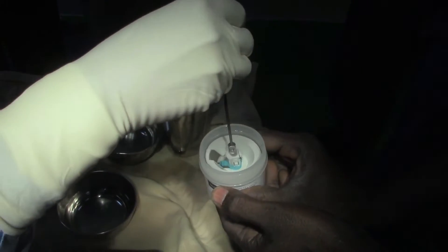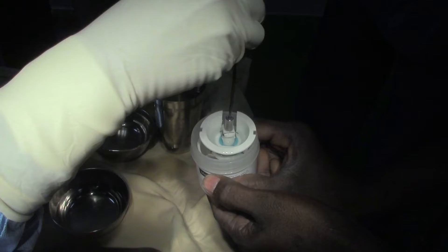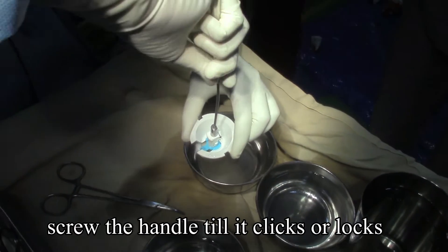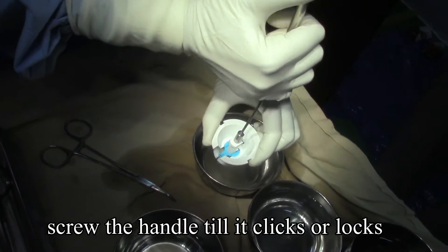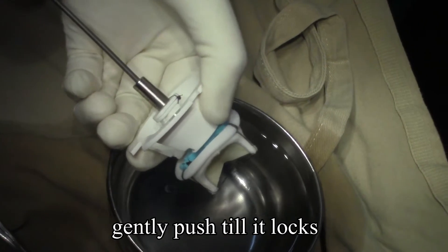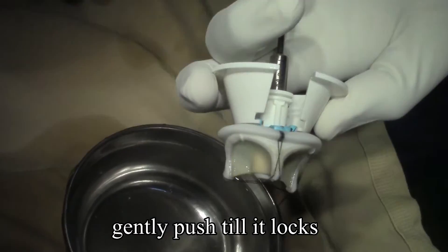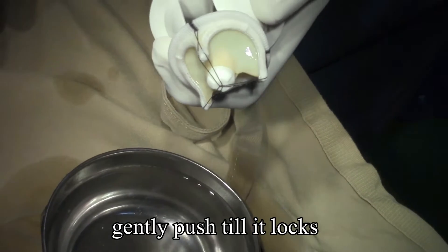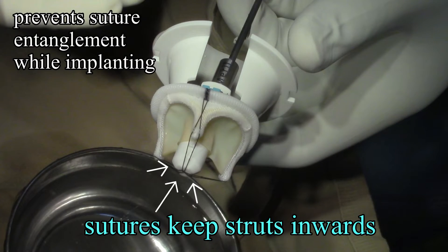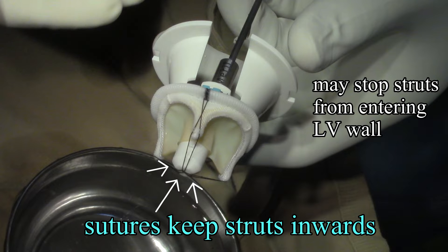Screwing the handle into the slot provided within the valve and gently pushing until it locks onto itself — you would be able to see the holder pop out a bit, putting the sutures under some stress. Those sutures keep the struts inside, preventing suture entanglement during implantation, and may also stop the struts from piercing the ventricular wall whilst implanting.